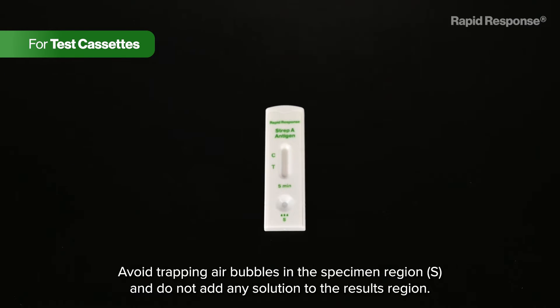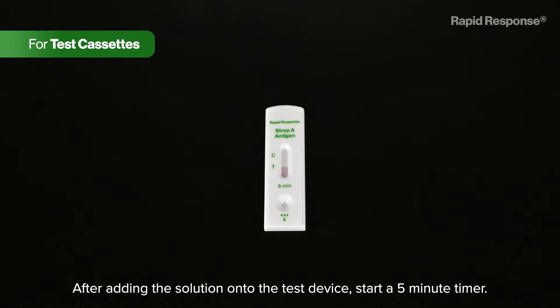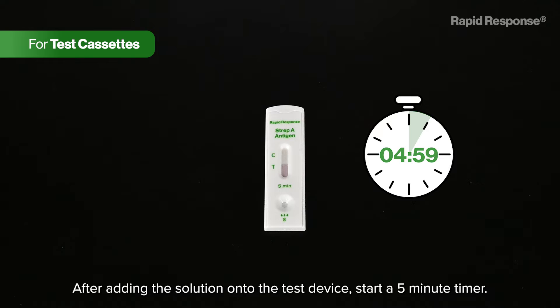Add three drops of the extracted solution onto the sample region of the test device. Avoid trapping air bubbles in the specimen region and do not add any solution to the results region. After adding the solution onto the test device, start a five-minute timer.